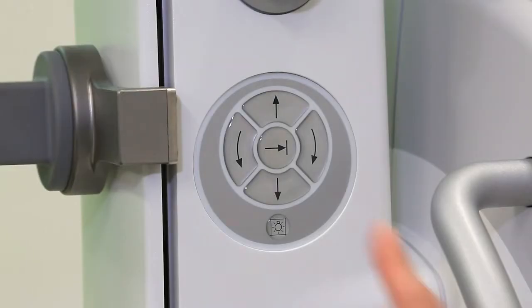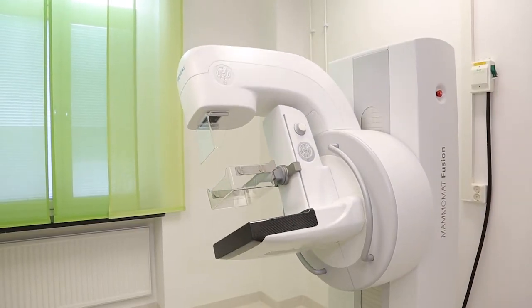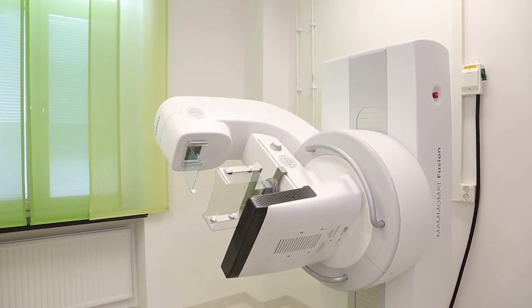The thin detector and the compression plates make positioning very easy. The single touch to move the system into the MLO position is really good. We already have MammaMath Inspiration and the use of the systems is identical, so learning how to use it was quick.